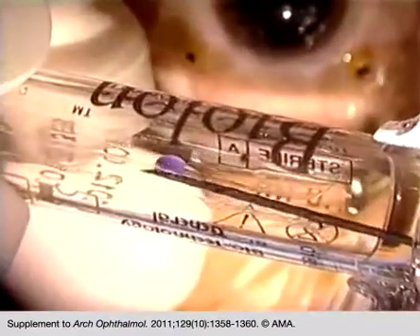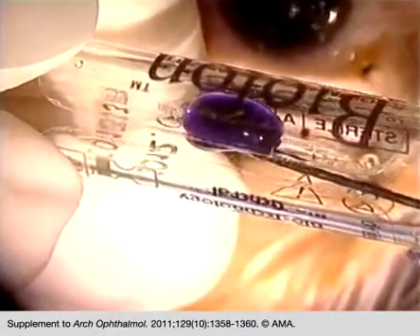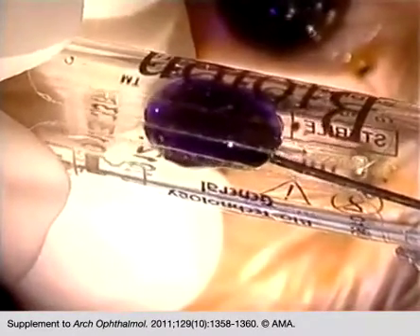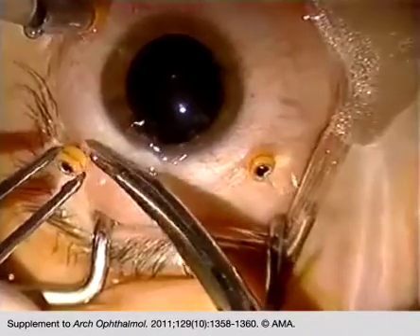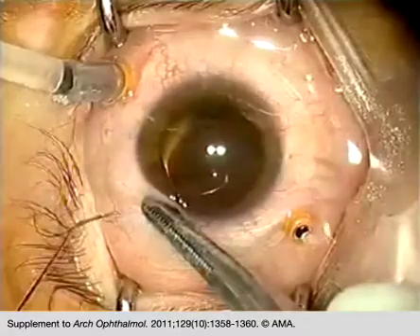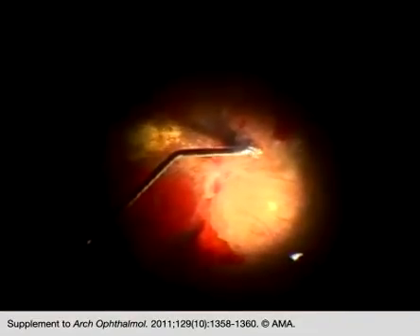We put back the stained viscoelastic into the original injector. We remove the corresponding gauge 23 cannula and use a gauge 30 curved needle. We inject the solution in between the posterior hyaloid face and the retina, such that a retinal map is visualized more easily.